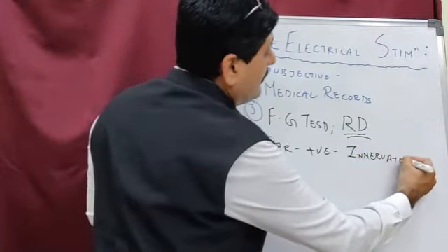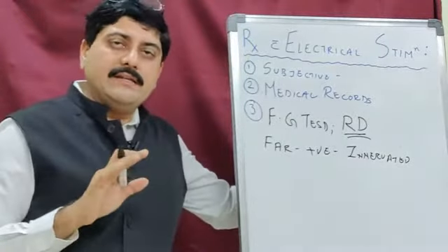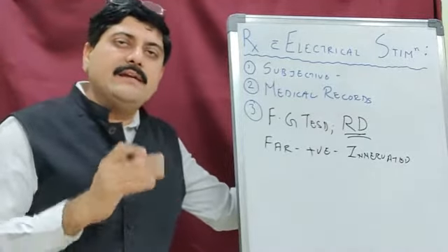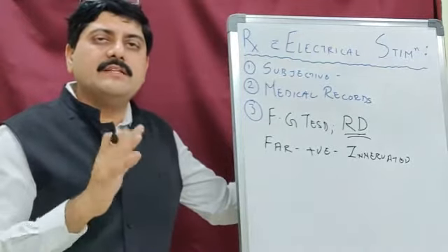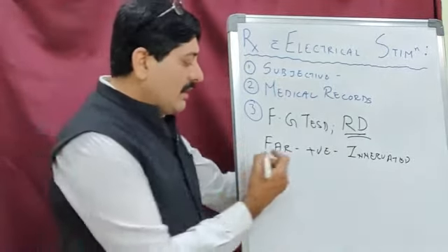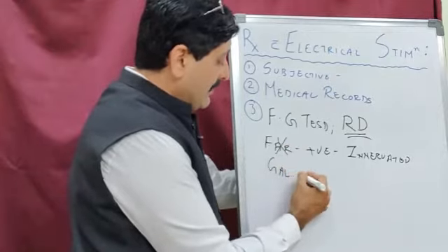innervated, right? Because if the motor end plate is intact, if the motor end plate is working, that means that the neuromuscular junction is okay, and the muscle and the nerve connection is okay. That is the first thing you have to identify, right? If the patient is not responding with Faraday, then we will go to stimulate with Galvanic, right?